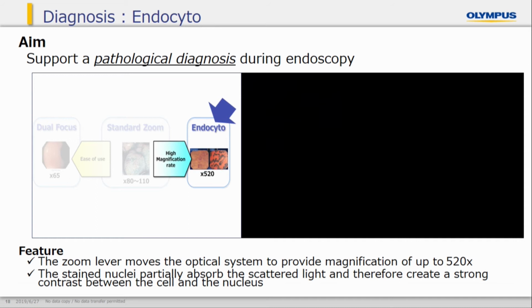On the other hand, the endocytoscope is available in the market now. In this morning session, Tajiri Sensei, Inoue Sensei and Yutaka Saito Sensei also touched upon this technology.